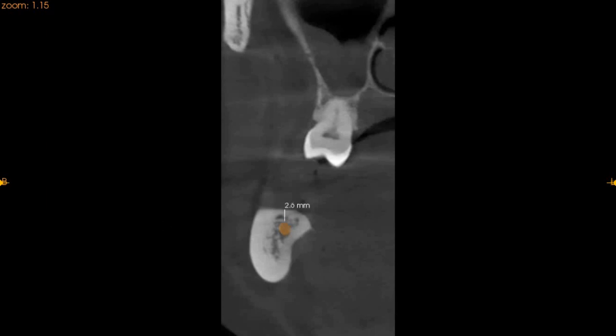Moving to the second molar region on the lower left, we have only 2.6 millimeters of ridge height from the crest of the ridge, but approximately 5.9 millimeters of ridge width buccal to the inferior alveolar nerve, and approximately 11 millimeters of ridge height. So if an implant needs to be placed on the buccal cortical plate there is still sufficient bone, but there is insufficient bone from the crest to the inferior alveolar nerve.